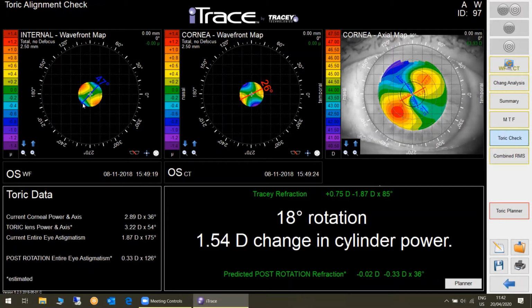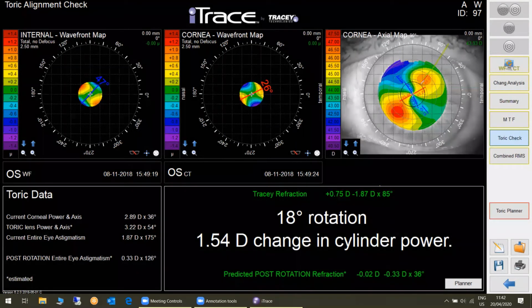I said, yes. So this means that you have done a good job. You've put the lens exactly where you planned. And then I saw it. I can annotate here. You see, I also have 51. See here? I also have 51. But the patient is only using the center. He has a small pupil, and she's only using this.